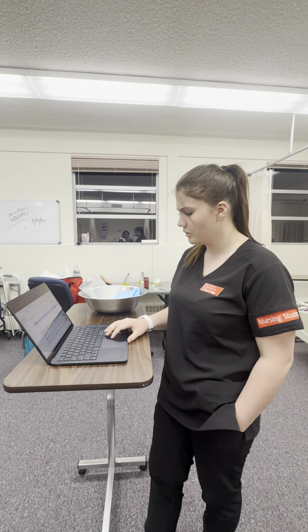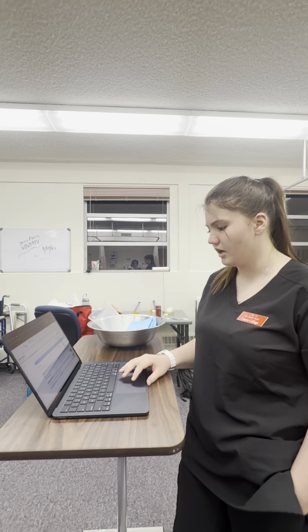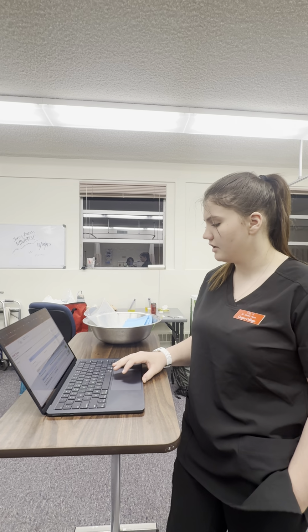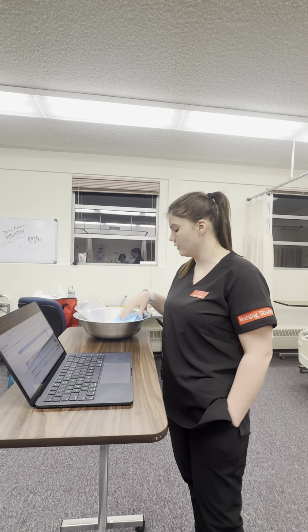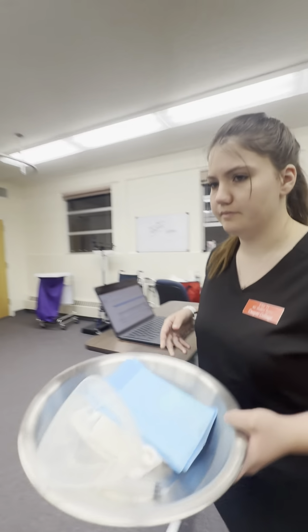It looks like I'm going to go down to his most current orders. Looks like we have a current order to discontinue his indwelling urinary catheter today, which is active and due now, so that's what we're going to do. I'm going to go ahead and gather all of my supplies for peri-care as well as for when I'm discontinuing, and I'm going to go ahead and head into the patient's room.